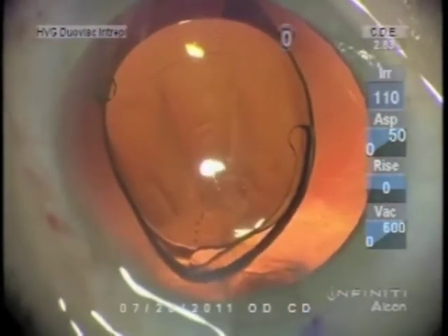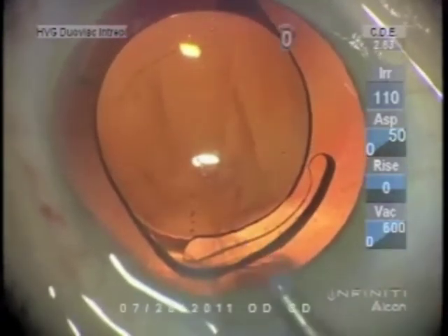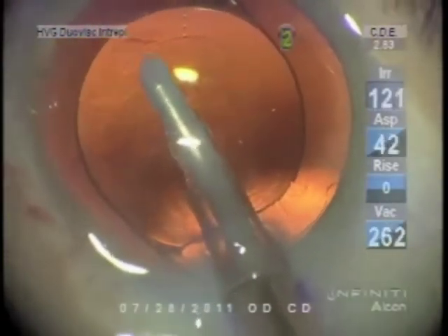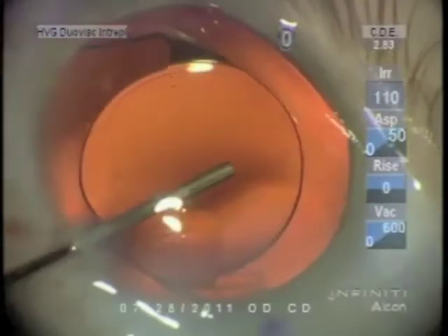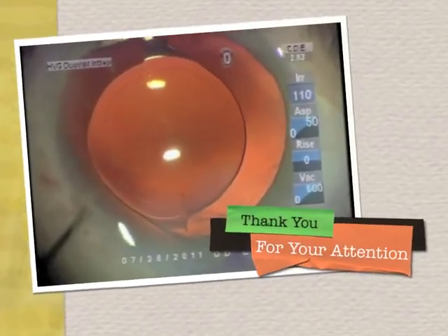We're using the wound to keep the fold of the lens as it's injected, and I just keep pushing the plunger out to use it as a spatula to get the trailing haptic into the capsule. For viscoelastic removal, I push down a little bit on the lens while I use high vacuum so that it doesn't propeller around with risk to the capsule.